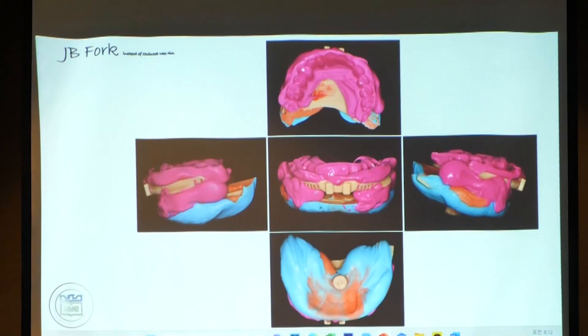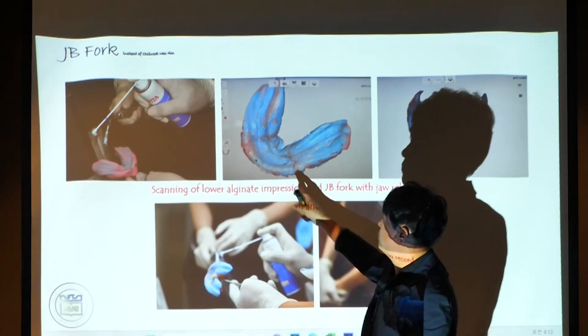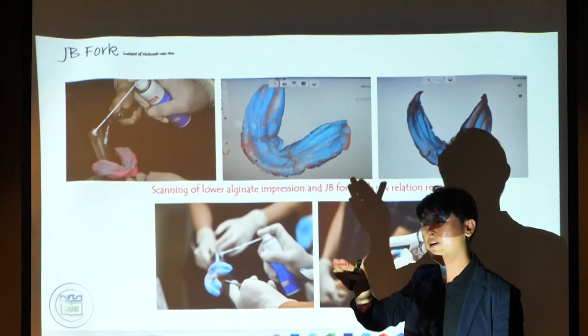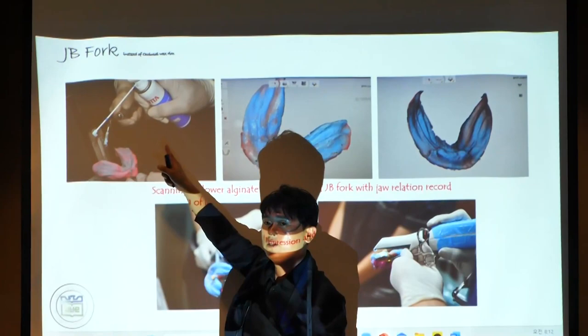So these are the finishing pictures. I took the impression with alginate. This patient has severe bone loss, so it's very difficult to do direct intraoral scanning. At that time, I took an impression with alginate, sprayed it with powder, and then scanned it directly.